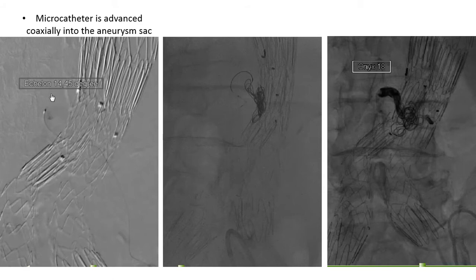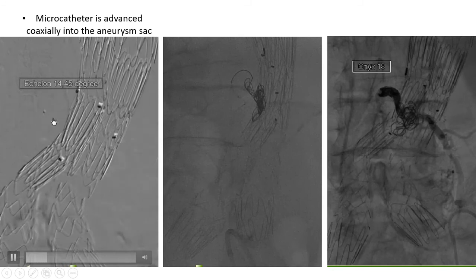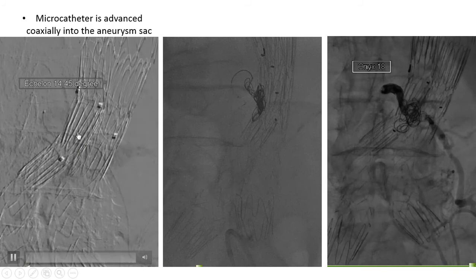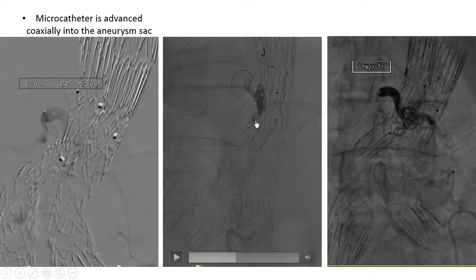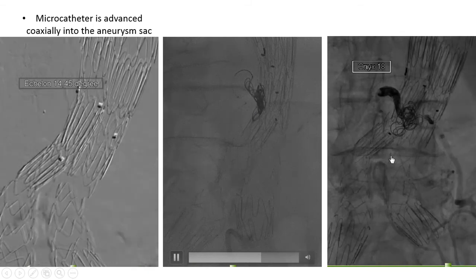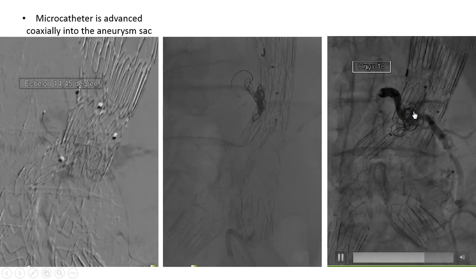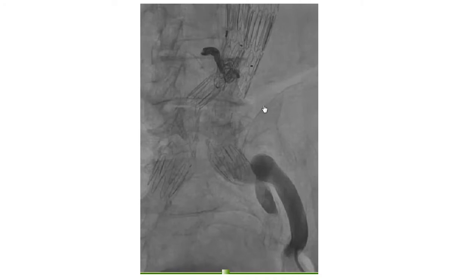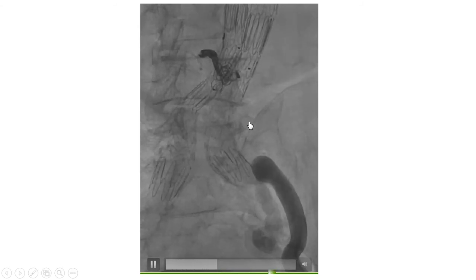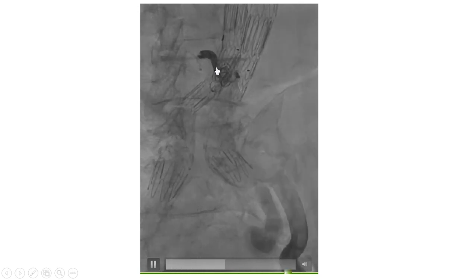Microcatheter Echelon 14 is advanced coaxially into the aneurysm sac. You can see the microcatheter reaching the aneurysm sac — it is the lumbar artery which drains into the aneurysm sac. We used two detachable Axium coils, six millimeter and seven millimeter, and afterward injected Onyx to complete occlusion of the lumbar artery and the aneurysm sac. You can see the final result on injection into the iliac artery: the coils in place and the Onyx injected into the lumbar artery.